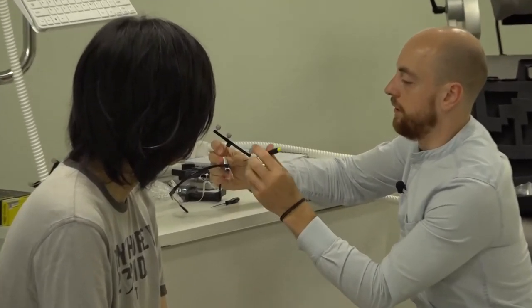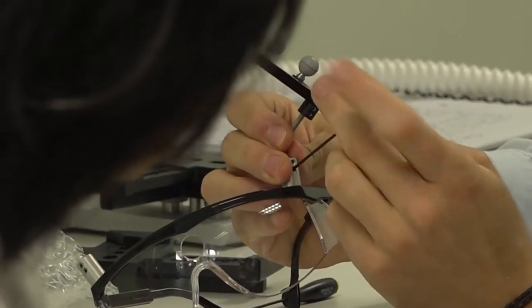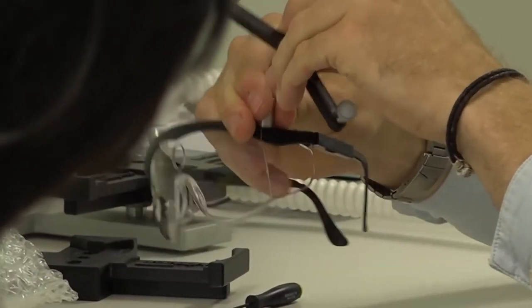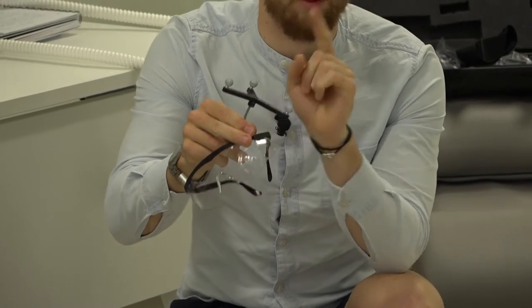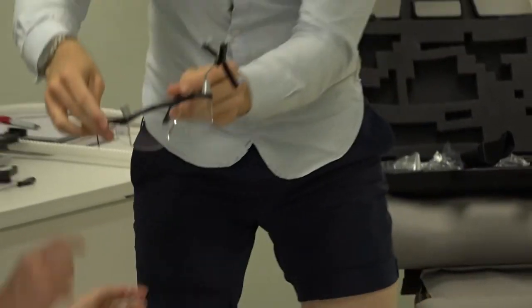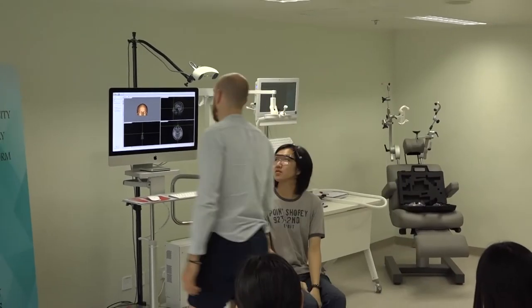And again, you want to get those tightened up just to stop that from moving around. But when that's in, it's worth giving that tracker a little wiggle just to make sure those little screws aren't on an edge. Otherwise, when you tighten them up, it'll jump around, and you don't want the tracker to move whilst you're on there. So if you want to pop those on, that's it, cool.